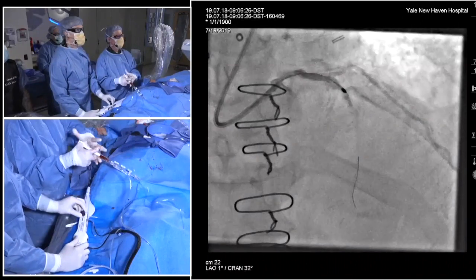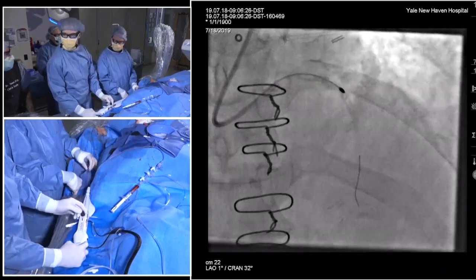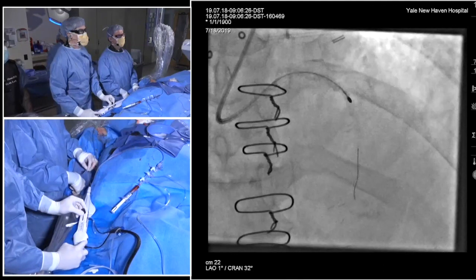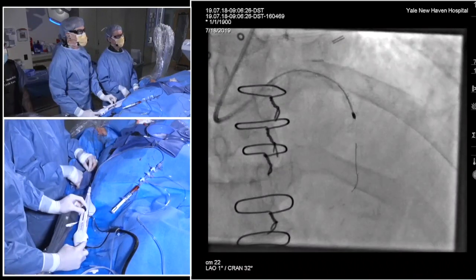Yeah, so I was actually going to comment on that, and I don't know if you could tell, but you don't hear anybody calling out what the decels are, what the times are, because this new console on the Roto Pro actually allows you to see that up front. It also has no foot pedal, so you still have everything in the handle with the activation in the handle.